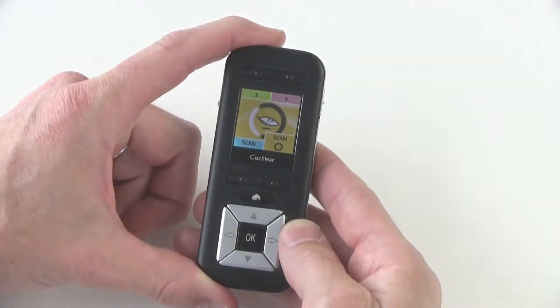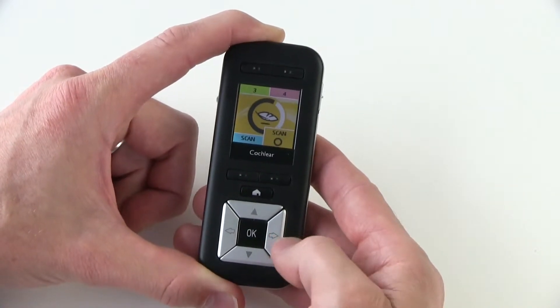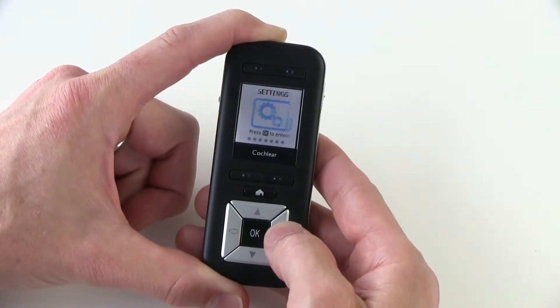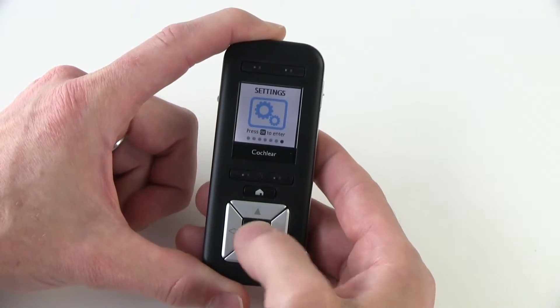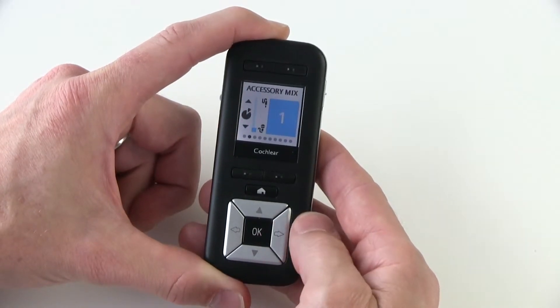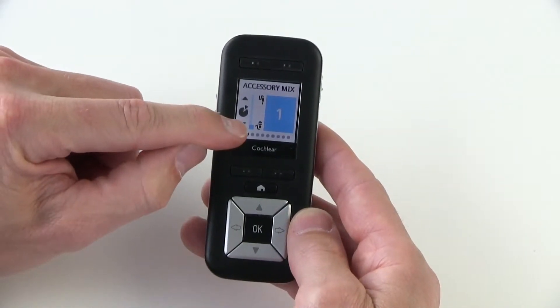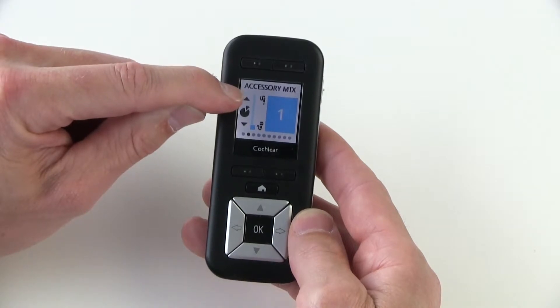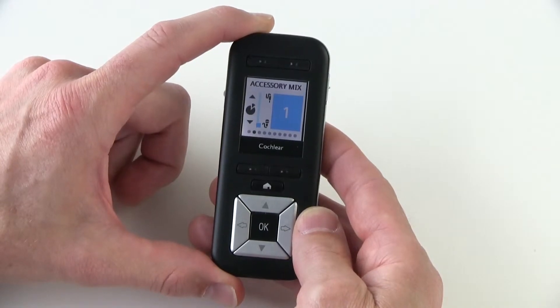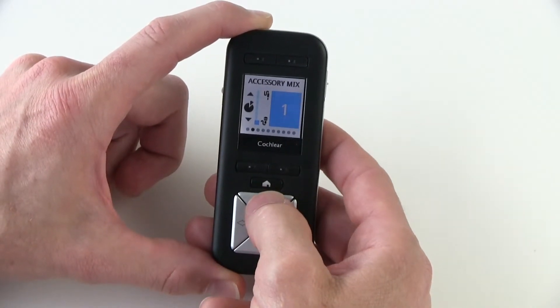To change the accessory mixing ratio using your CR230 remote assistant, from the home screen use the right arrow button and select over until you reach the settings screen. Click OK and you'll find yourself in the telecoil mixing ratio screen. Select over one to accessory mixing ratio — you can see that this deals with the input from your processor microphones compared to the input from your accessory. This applies to both wireless and wired accessories. To change the mixing ratio, simply push the up or down arrow buttons to select the number that you prefer.